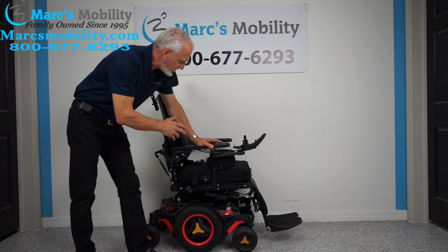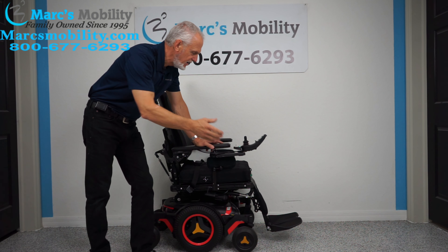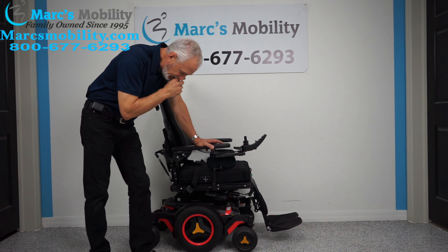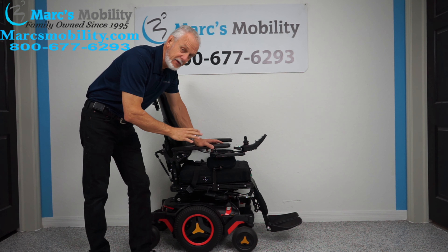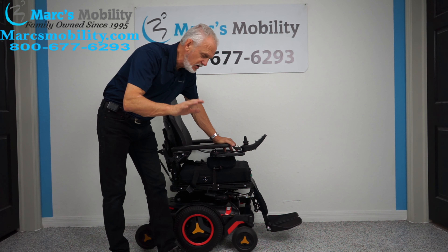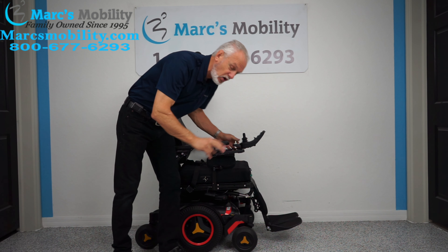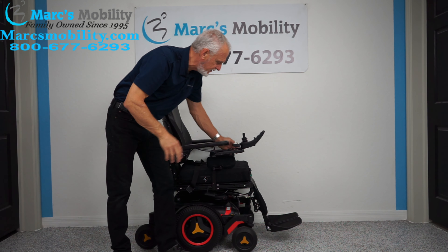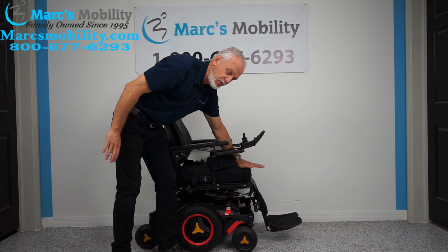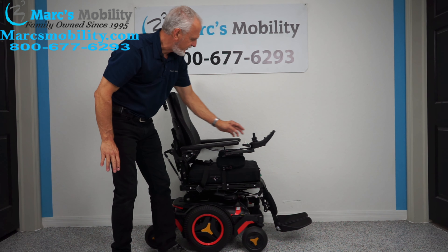This chair is loaded — it has a 12-inch seat lift, electric tilt, electric reclining, and electric feet. One thing to remember about this chair: it was built this way from the factory. The seat sits at 24 inches, so if you buy this chair the seat cannot go lower than 24 inches. Most chairs start at 22 inches, so you're starting two inches higher than most. The low position of the seat is 24 inches.